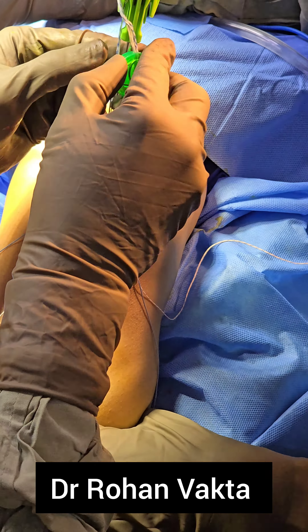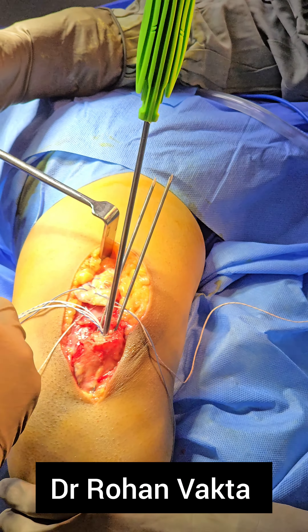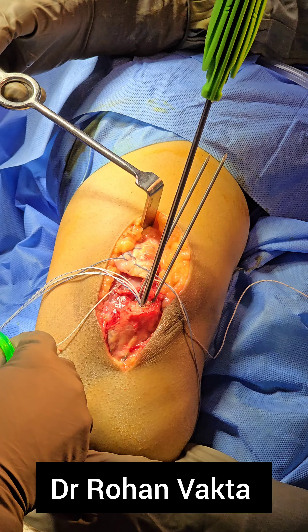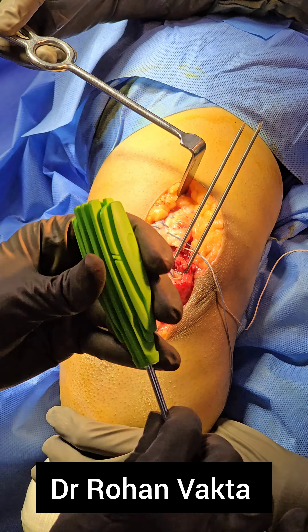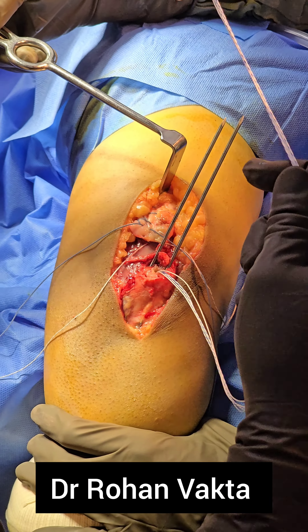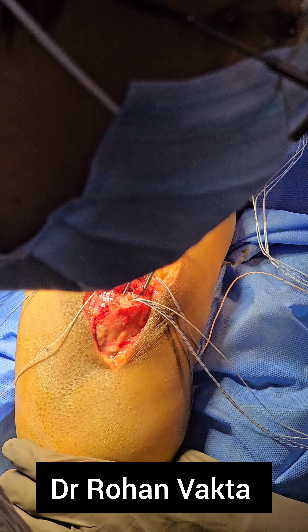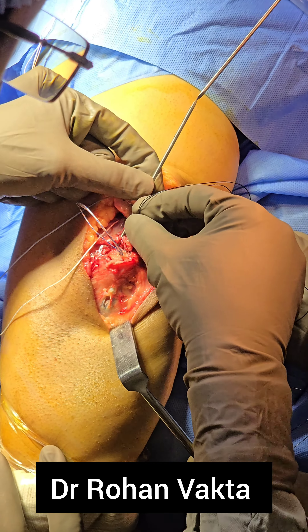As you can see, in the center the suture anchor is used. The advantage of this suture anchor is that it is pre-loaded with an attached needle, so you don't have to use a separate needle to pass the suture. Once the suture anchor is placed, all the fiber wires are passed through the distal most part of the triceps tendon from proximal to distal and medial to lateral direction. It is a double-loaded suture anchor, so there are a total of four strands and all four strands are passed.